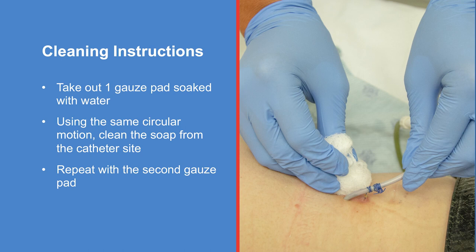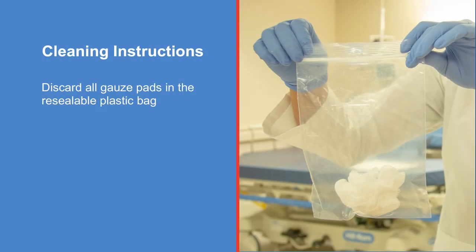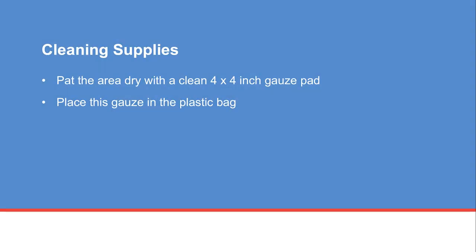Take out one gauze pad soaked with water. Using the same circular motion, clean the soap from the catheter site. Repeat with the second gauze pad. Discard all gauze pads in the resealable plastic bag. Pat the area dry with a clean four by four inch gauze pad and place this gauze in the plastic bag.